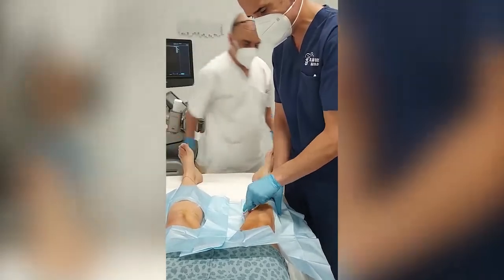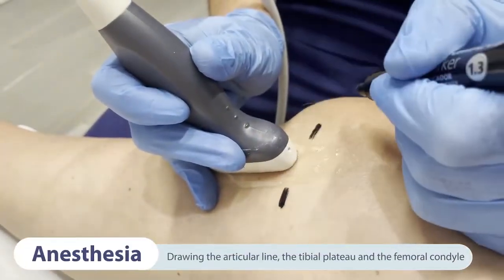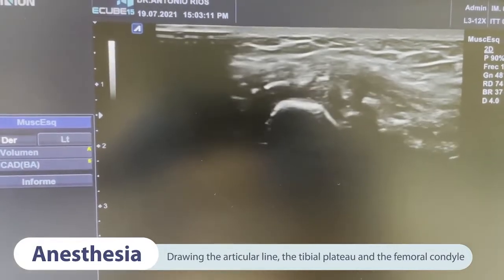After blood extraction, the patient is placed on the operating table in the supine position. The first step consists of drawing the articular line, the tibial plateau and the femoral condyle with ultrasound guidance.